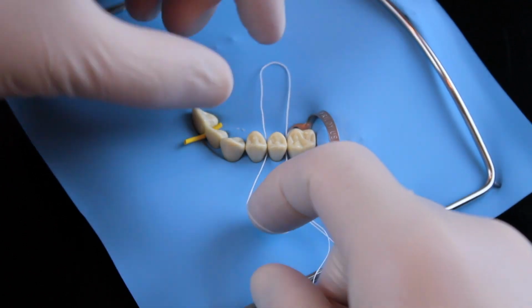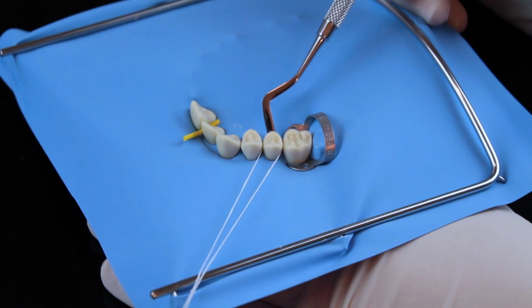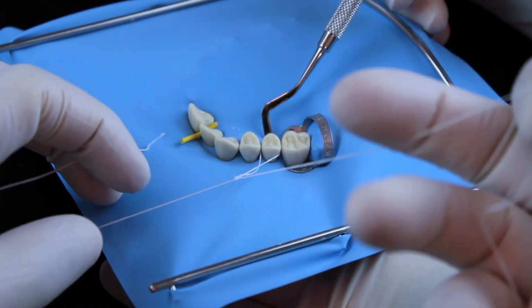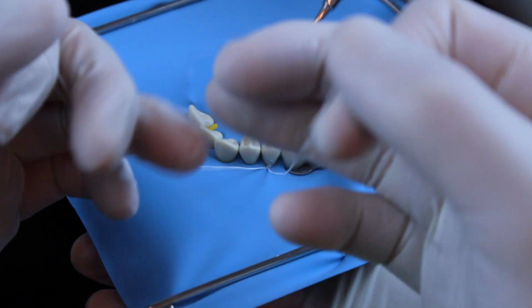I suggest leaving the loop longer so that you can floss the tighter contacts easier than with a tiny loop. The most important part when you start tightening it is that the floss is below the equator. That's easiest if your assistant holds it there with a flat instrument. By moving the knot a bit left and right while tightening it, you will push it further down.